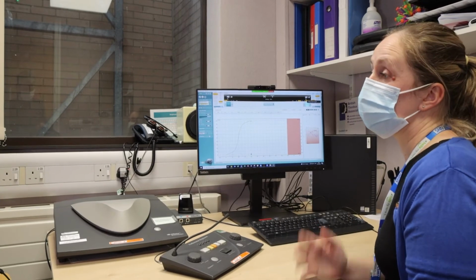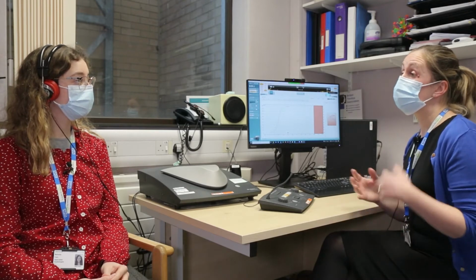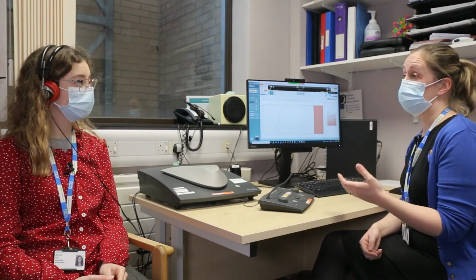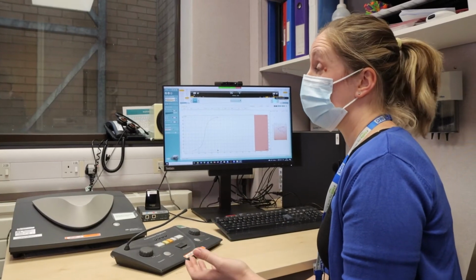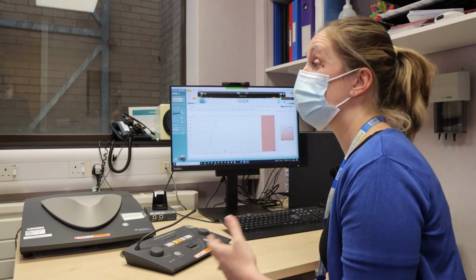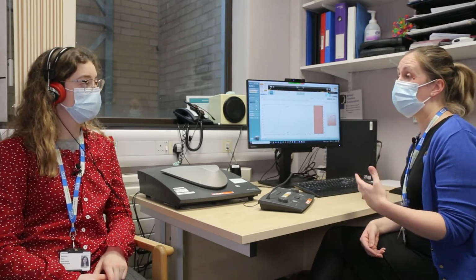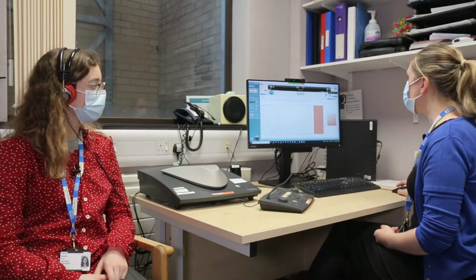So before we start, we're going to instruct the patient. So we're now going to do some speech testing. This time, instead of hearing tones, you're going to hear words. So it's a male voice, and you'll hear very short words like cat and dog. And all I need you to do is to repeat those words back to me as soon as you hear them. If there are any words where you're not sure, then take a guess, or if you just hear a part of the word, say the sound that you've heard, because it will all count towards your score at the end. Is that okay? Yeah. For some of the tests, you're also going to hear some background rushing sounds, so just ignore that. And if it becomes uncomfortable at any point, then let me know. Okay. So we're now ready to start.